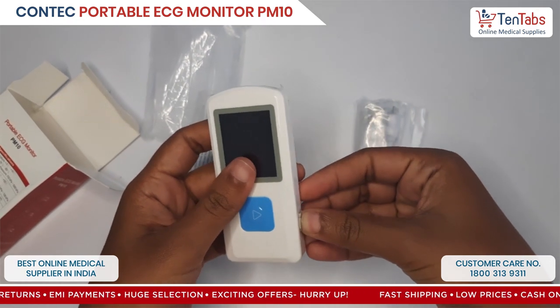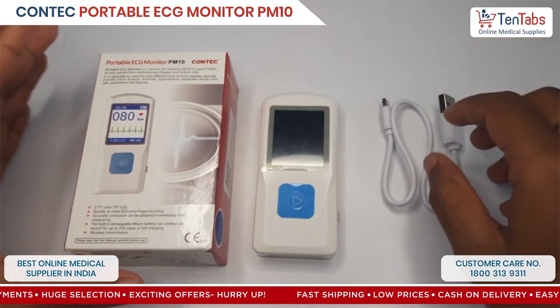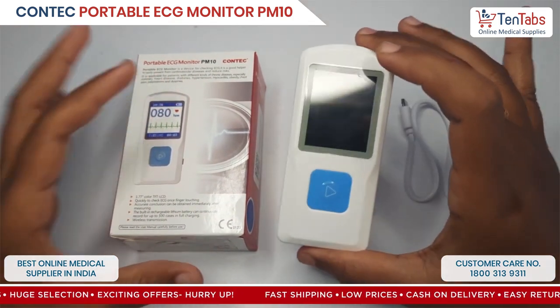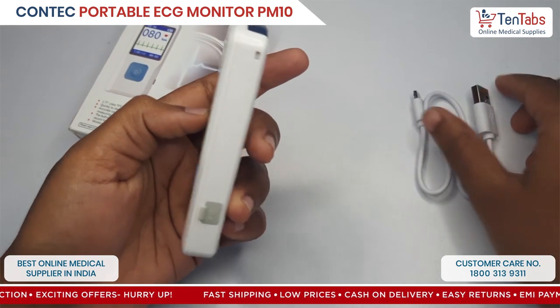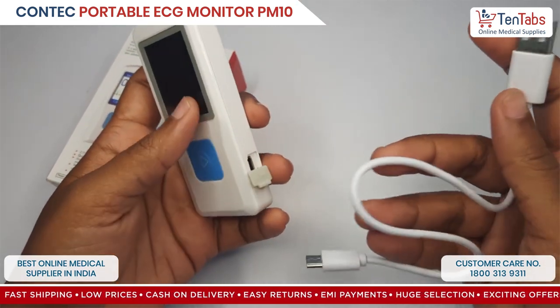Now let's see the installation. The first step in installing the device is to charge the machine. The device can be charged by using the micro USB cable.